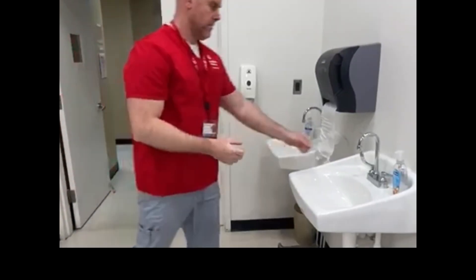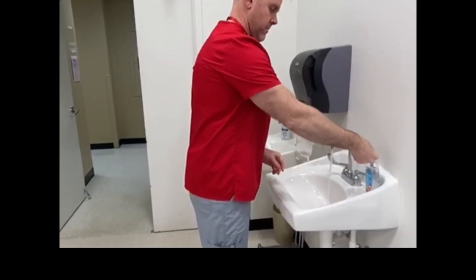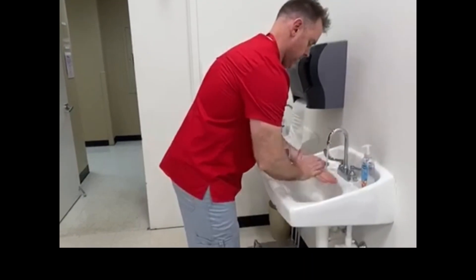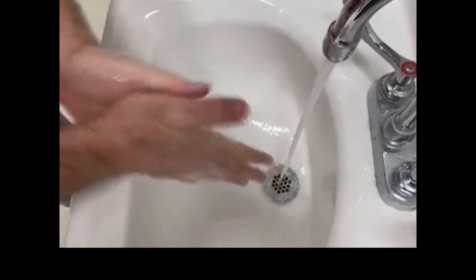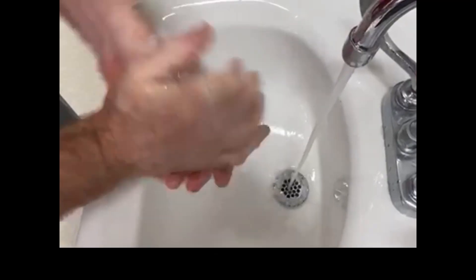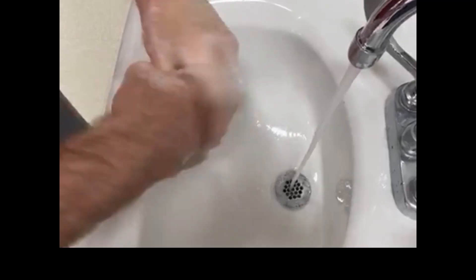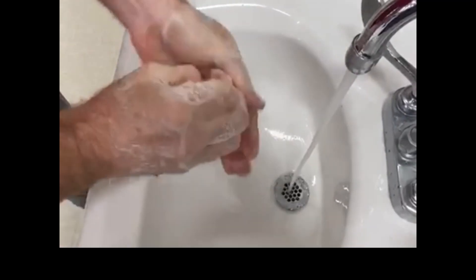Prior to entering the patient's room, perform hand hygiene. Wet hands with warm water. Apply liquid soap to the palm of the hand from the dispenser provided. Rub hands vigorously to work up a full lather. Pay particular attention to the areas between the fingers, under the nails, and rub for a minimum of 20 seconds.